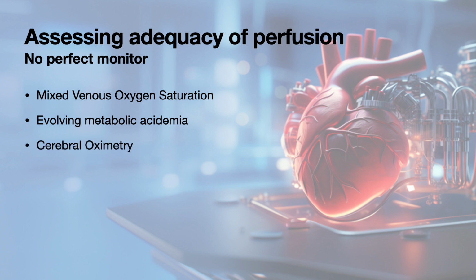Outcome data on cerebral oximetry is hardly conclusive, but to the extent that it tells us something about oxygen delivery to the brain, normal cerebral oximetry might be reassuring. On the other hand, in almost all other physiologic states, the body preserves brain perfusion almost at all costs.